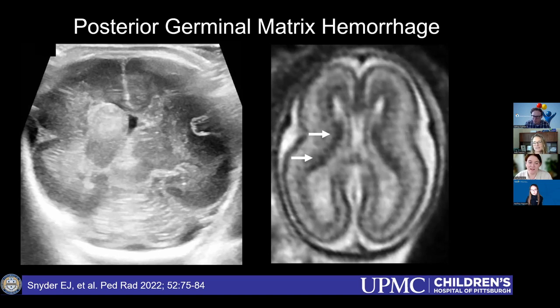Yeah, I take a similar stance as you, especially if the patient presents with intraventricular hemorrhage and they're dilated at the time of initial bleed identification, then it's a grade 3. But then I say evolving intraventricular hemorrhage and describe how the hydrocephalus has changed. But you're right, Judy. This is where it would be so great to sit down in a room with a bunch of people and say, how do we really want to do this better?